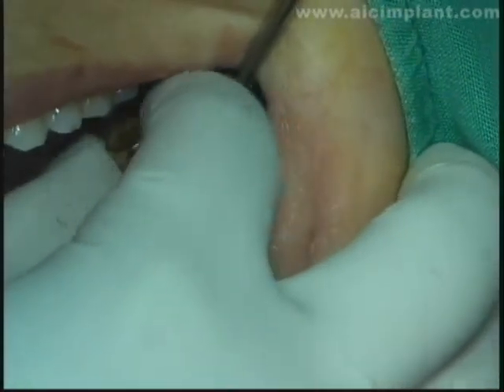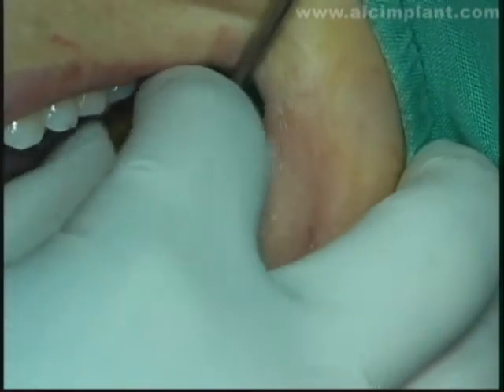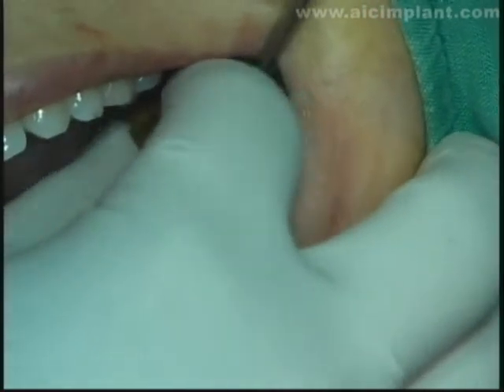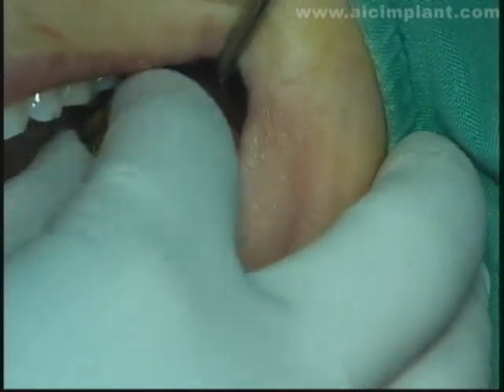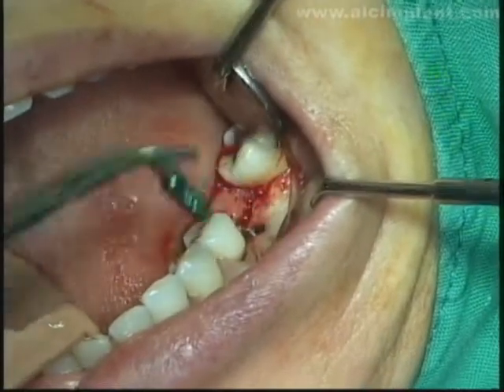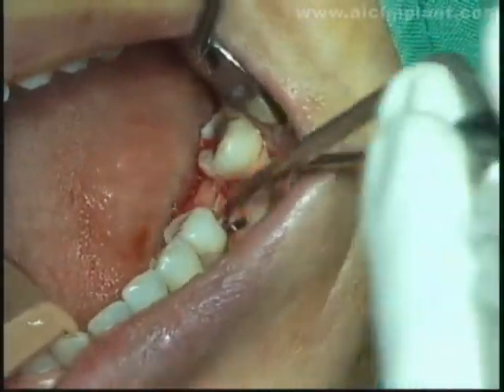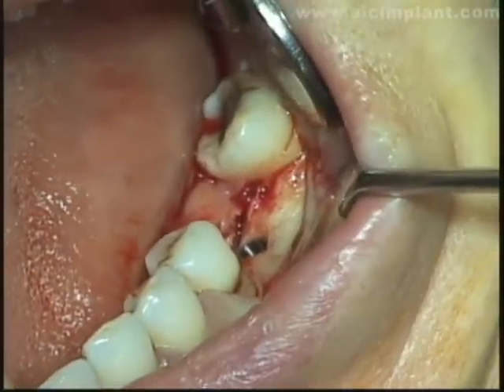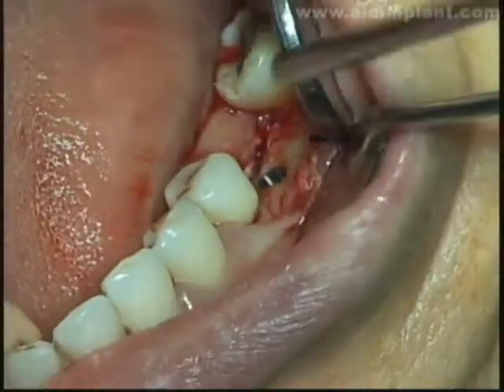You can easily remove the fixture mount by turning it like this. If the fixture fixation is not good and is performed at less than 20 Newton-centimeters torque, the fixture may move around with the mount during the removal of the fixture mount. Let's now connect the healing abutment.